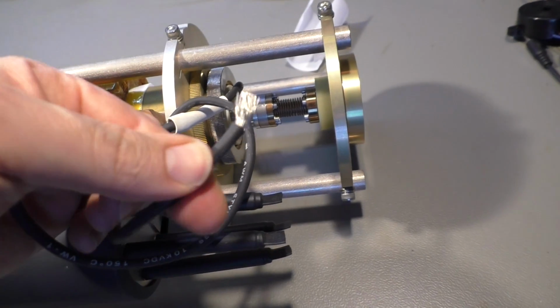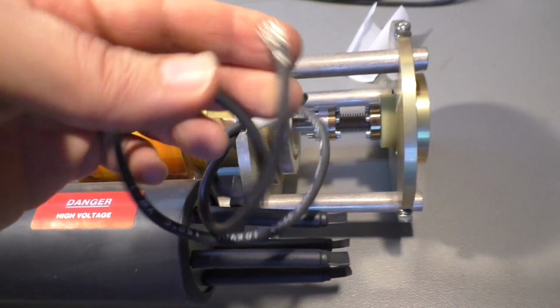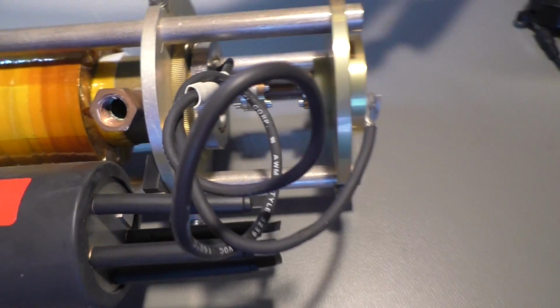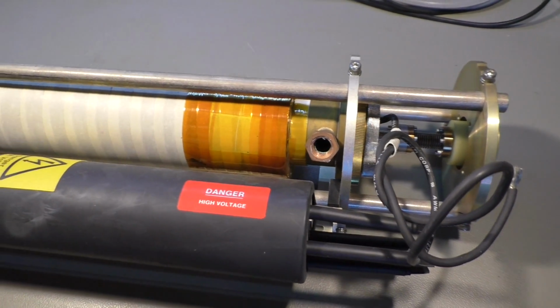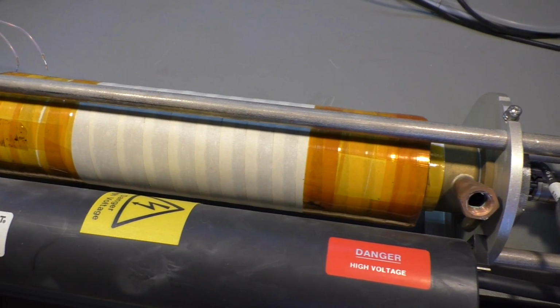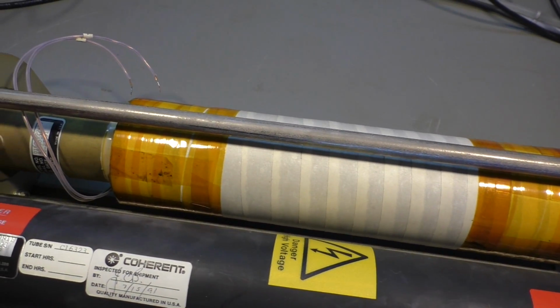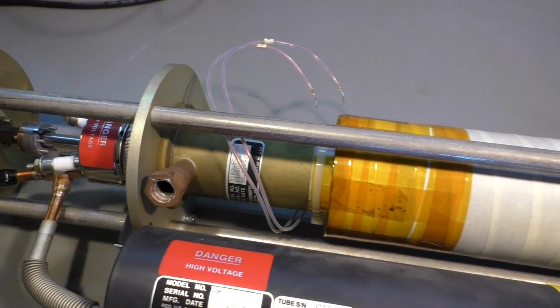The voltage here is about 200 volts, maybe a little bit higher for the big tube here. The burning voltage, and it also needs a starting voltage, a high voltage peak of maybe 3 to 5 kilovolts to ignite the discharge inside the tube.